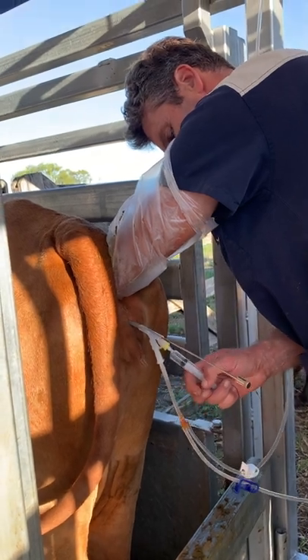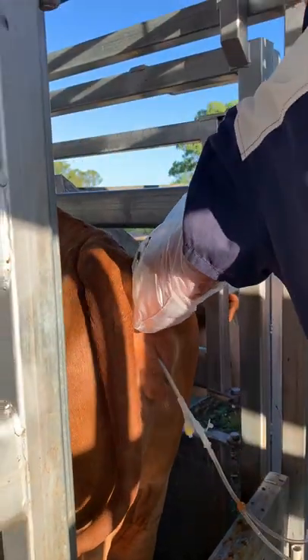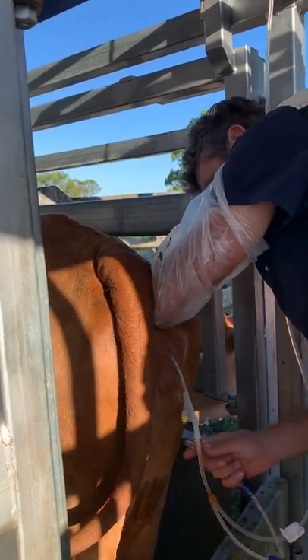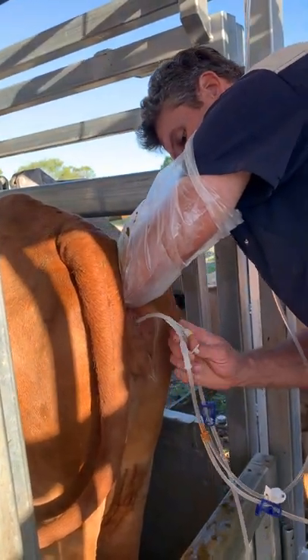So you're not going all the way to the back of the horn? To the tip of the horn. There's a blind end in the tip, but it's not really a blind end. There's a little fallopian tube opening there. So the egg cells actually enter in the tip of the horn.